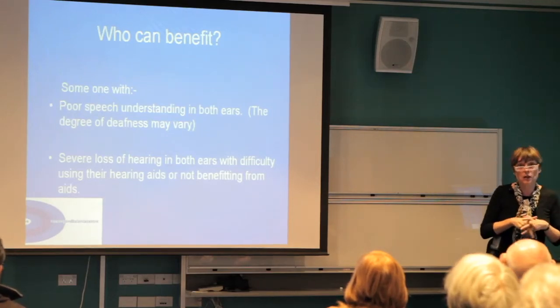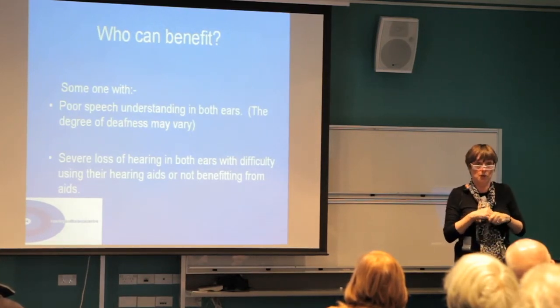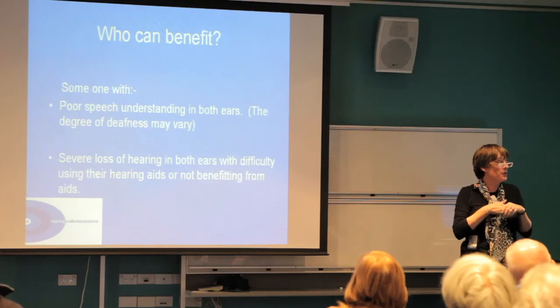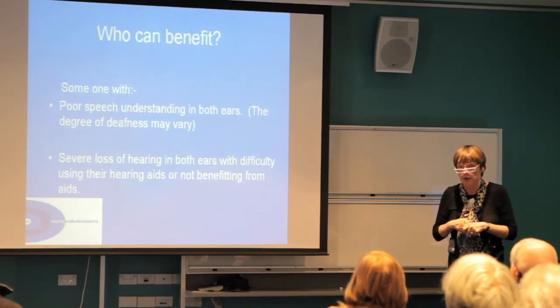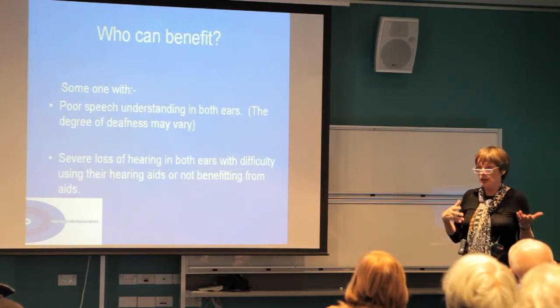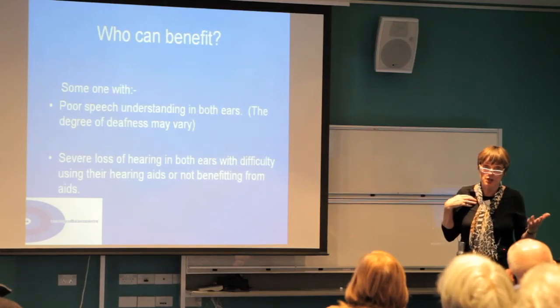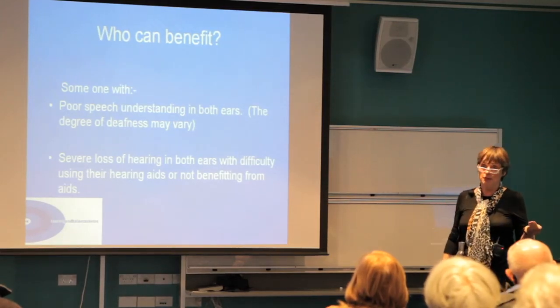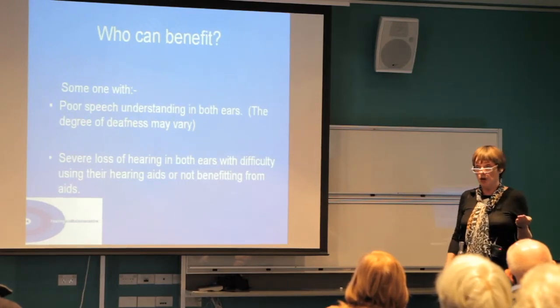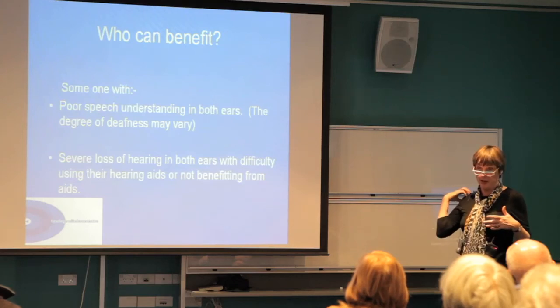Obviously, someone with a severe loss of hearing, as I've previously talked about, would be a candidate. Someone with an extensive hearing loss or a difficult hearing loss. And also someone who's unable to get the full benefit from their hearing aids because of practical problems would be a candidate. So someone with a severe loss of hearing who has difficulty managing their molds, or they get repeated infections, or they get lots of feedback that can't be improved. These people can often benefit from a cochlear implant. They may not fit other criteria, but it may end up just being that practically they're better with a cochlear implant.